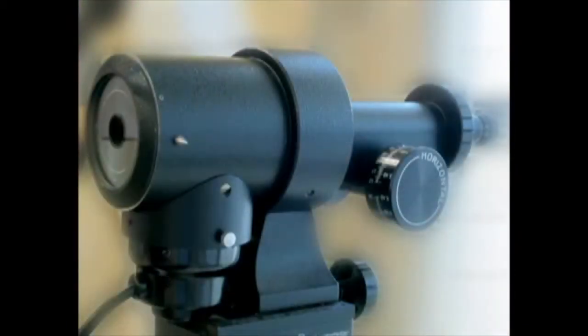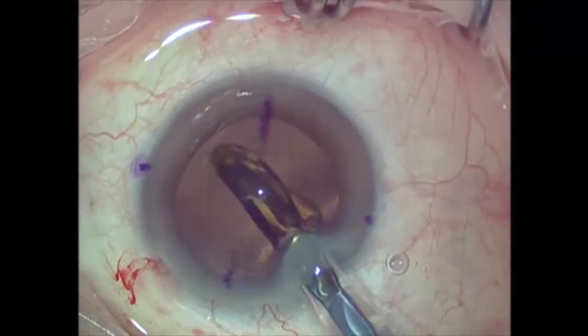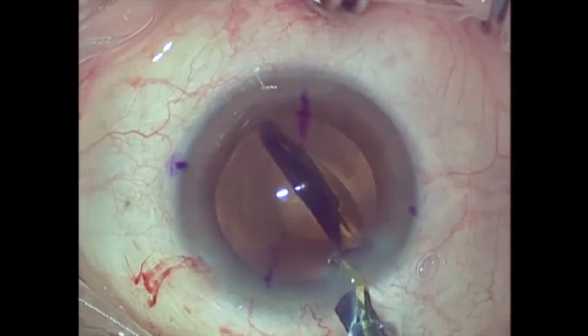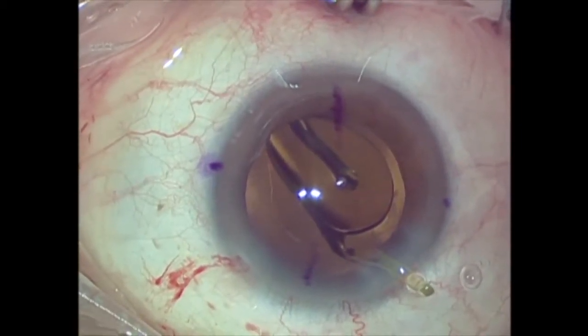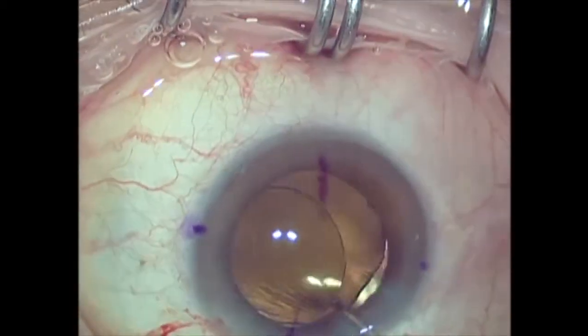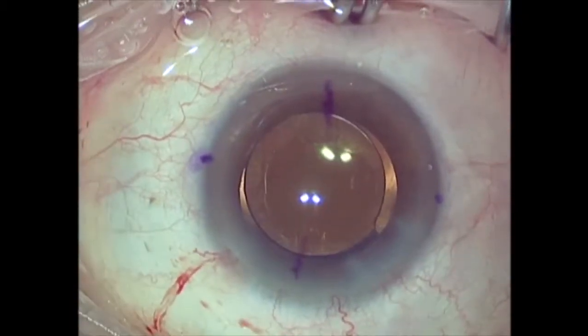Some authors consider manual keratometry to work best, and try to be conservative in correcting astigmatism, because even somewhat undercorrected, these patients do well. Irregular astigmatism patterns and determining the axis of astigmatism still remain the two biggest challenges when dealing with toric IOLs, because no single instrument will give the right answer all the time.